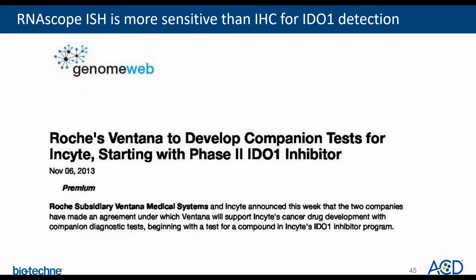This is another example of use of RNAscope as a companion diagnostic. This is a press release from Roche's Ventana in 2013, where they described their intention for developing a companion diagnostic test for Incyte using IHC assay for the small molecule IDO1 inhibitor.